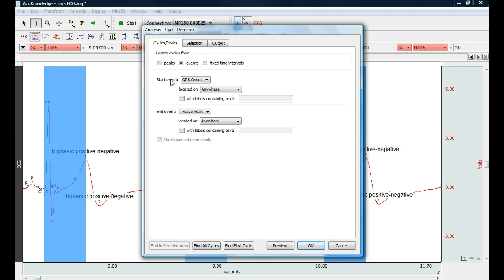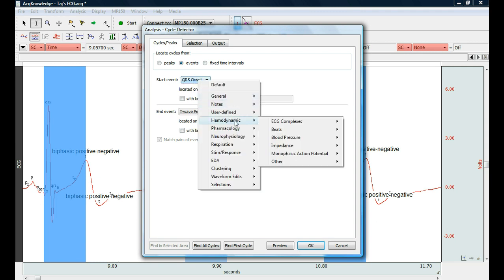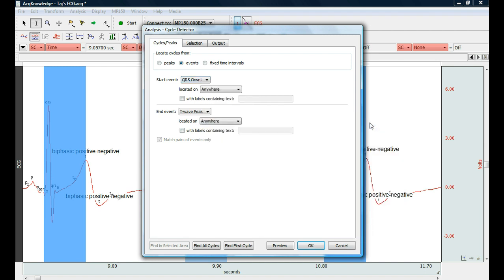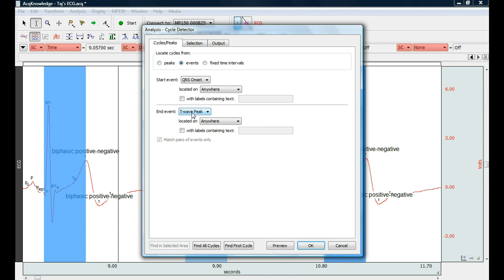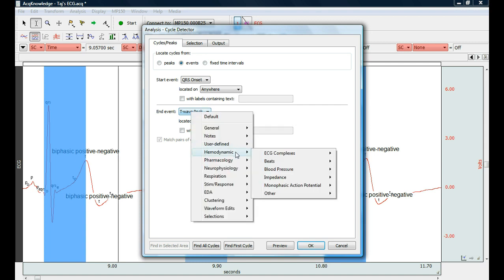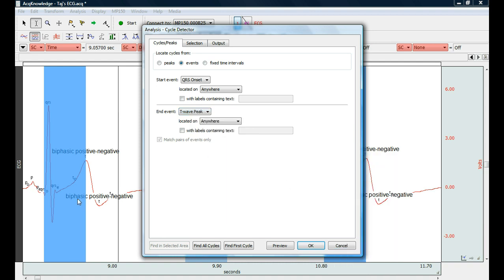And the starting event is the QRS onset which is found in hemodynamic ECG complex. QRS onset I had these preset. And the ending event is the T wave which is also under hemodynamic ECG complexes. T wave peak and it gives us an example here.